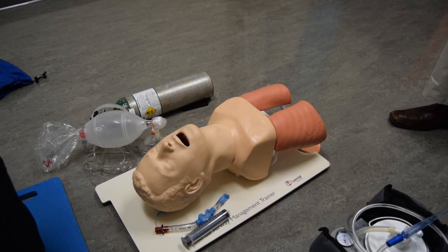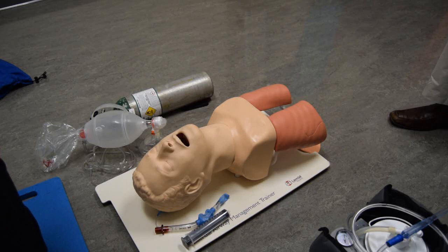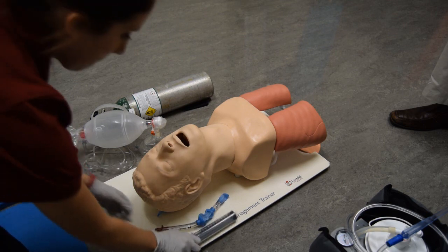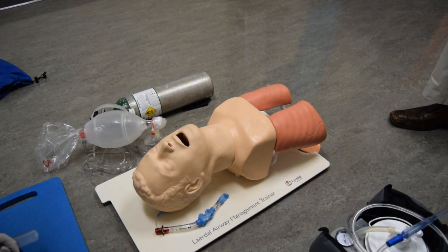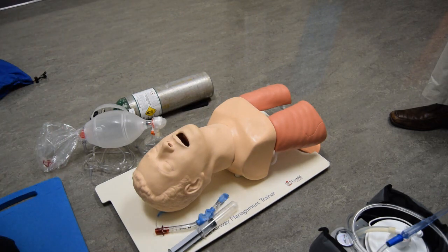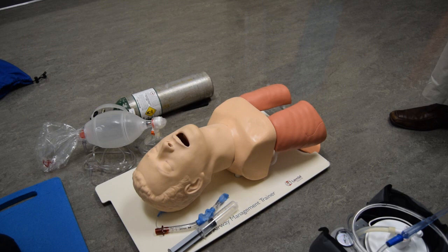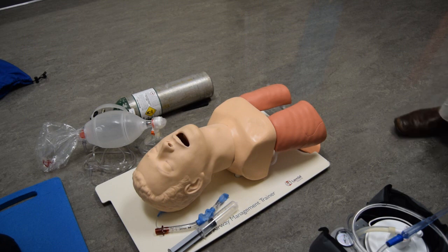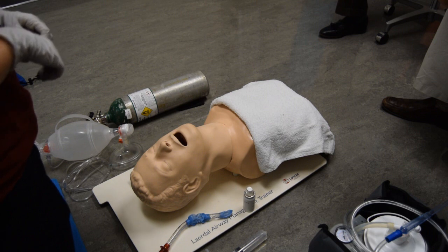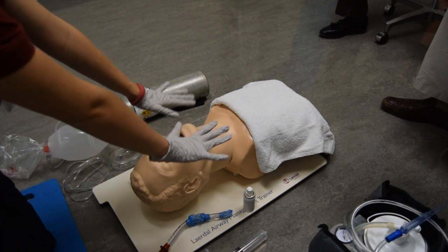Upon arrival to the scene, you observe the patient go into respiratory arrest and become unresponsive. A palpable carotid pulse is still present. Bystander ventilations have not been initiated. The scene is safe and no hemorrhage or other immediate problem is found. Takes or verbalizes body substance isolation precautions. Scene safety and BSI confirmed.